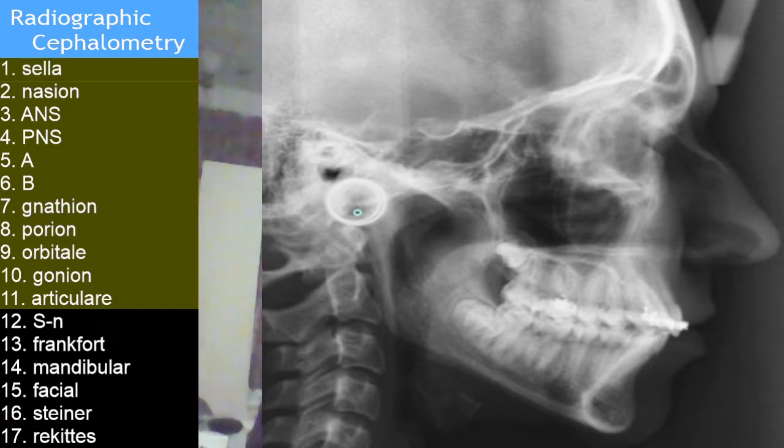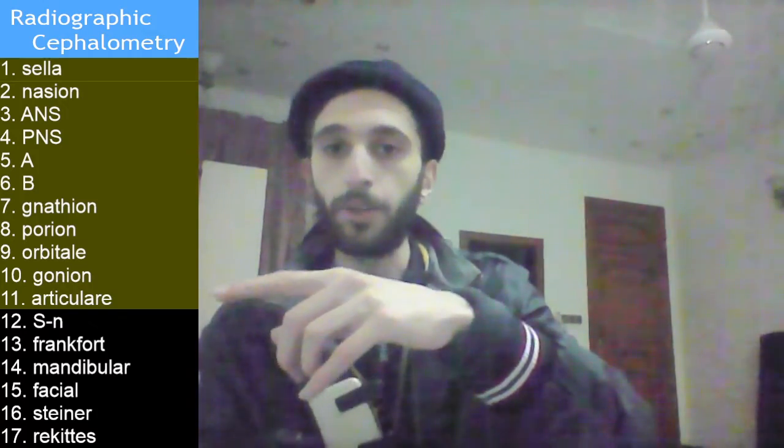Again, it is the junction of the posterior ramus plane and the superior structure of the skull. There is another definition to the articular, and it is the point of intersection of the dorsal contours of the process articularis mandibulae and the temporal bone.